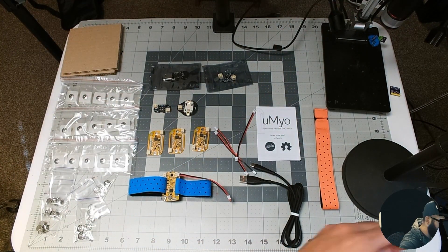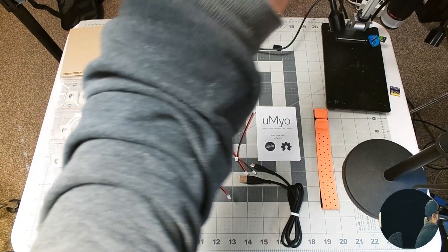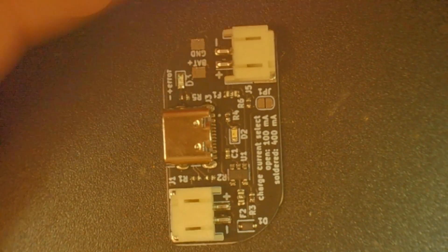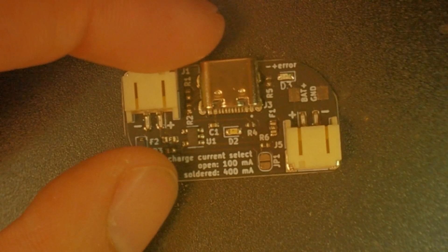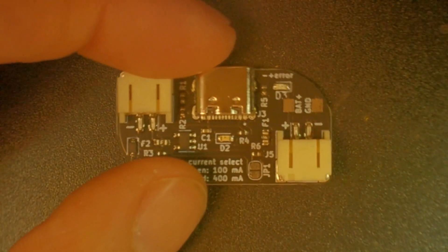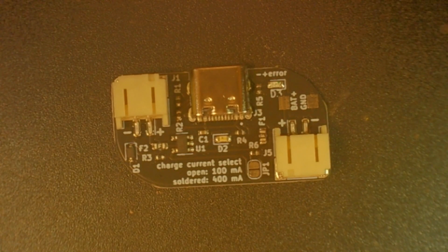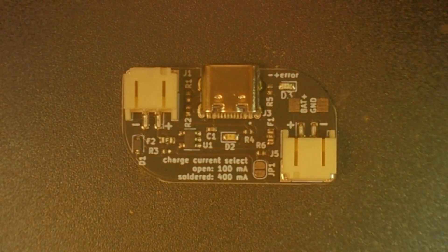Let's take a look at these under the microscope. Here is the U-Myo device with the two electrodes on either end. And here is the charging circuit — looks like it comes with a jumper. If it's open, it's 100 milliamps; if it's closed, it's 400 milliamps. So we can change the current if we need more. Pretty neat, pretty tiny.